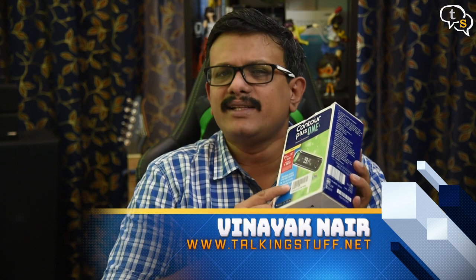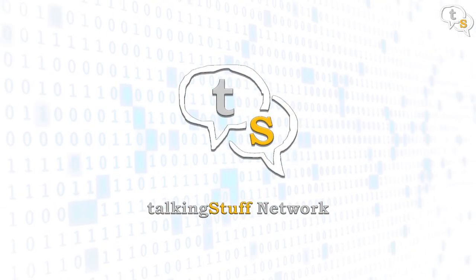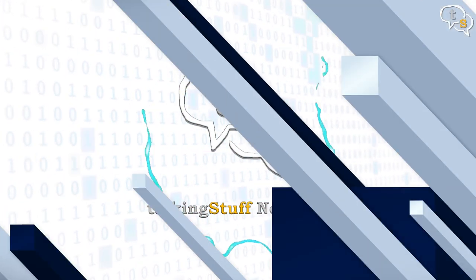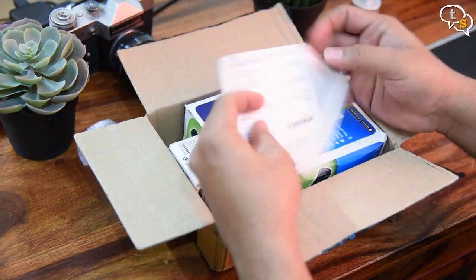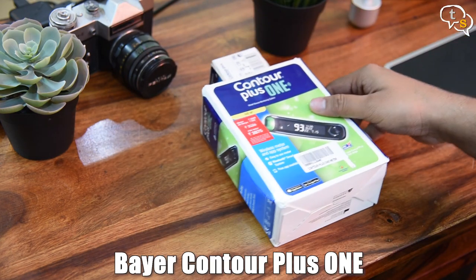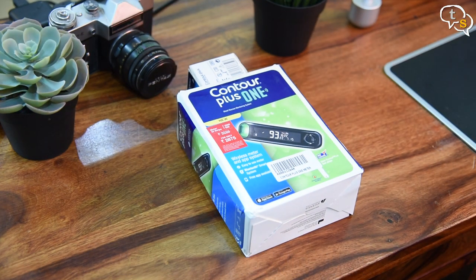Are you on the lookout for a smart glucose monitoring system? This sleek, affordable and easy-to-use device may be what you are looking for. Today we are unboxing the Contour Plus One, a smart glucometer by Bayer — smart being that it works via Bluetooth and syncs to an Android or iOS app.